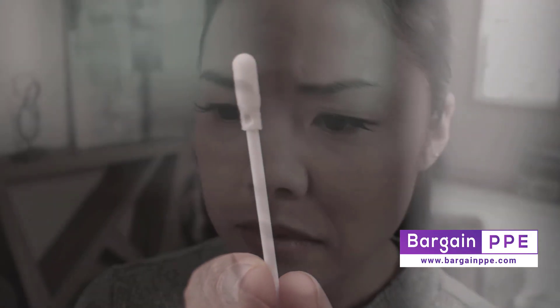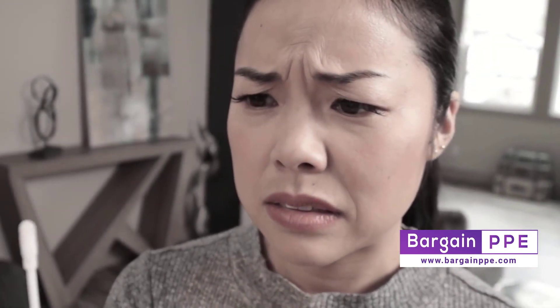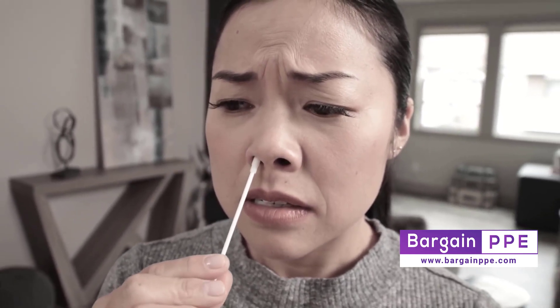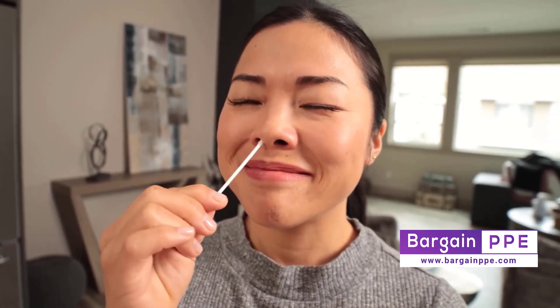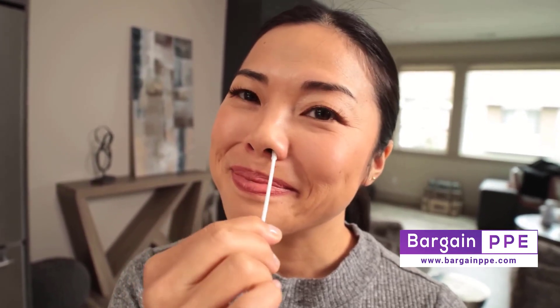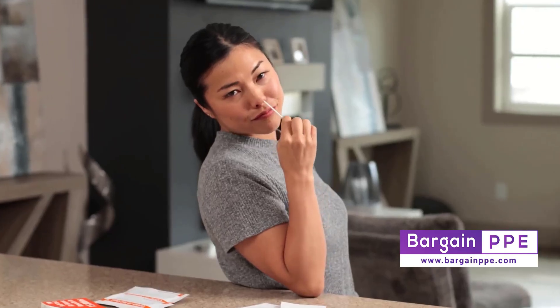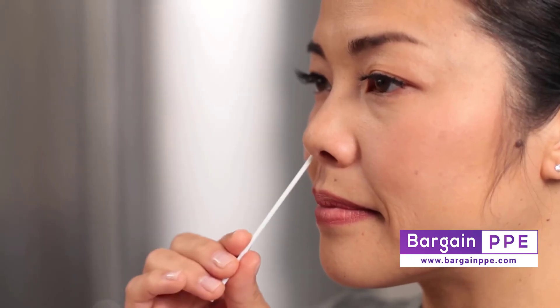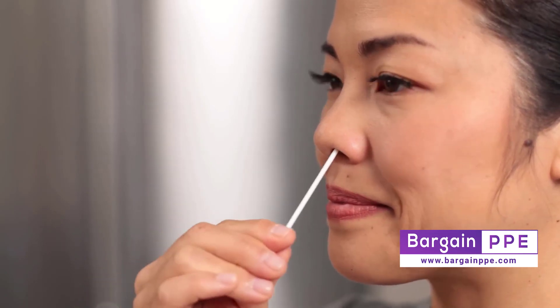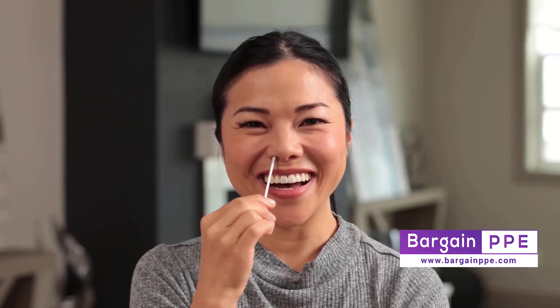Which brings us to the fun part we know you've been looking forward to. Yes, this thing's going inside of your nose, but lucky for you, the iHealth rapid test swab is specially designed for simple, comfortable testing. It barely has to be inserted into the nostril — about a half to three quarters of an inch. With the swab inside your nostril, swab in a circular motion as if you are cleaning the inside of your nose. Note that this is not a matter of simply twisting the swab in place. When you've finished, swab your other nostril the same way.